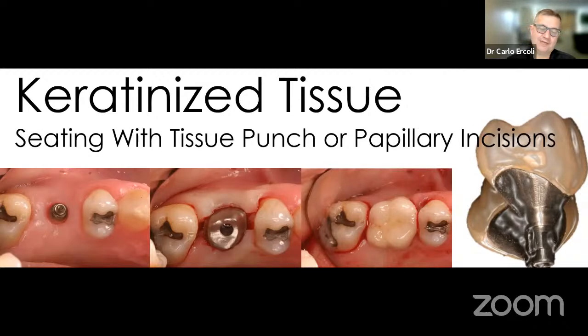But making that incision in the interproximal area breaks down the cuff of fiber in that soft tissue, so that as you seat your crown, the crown will extend and stretch that tissue without any problem. And often there isn't even a need to put any sutures around those two little papillae that have just been pulled apart.